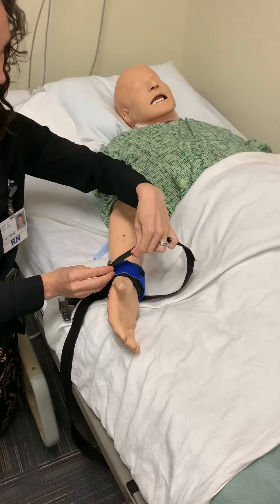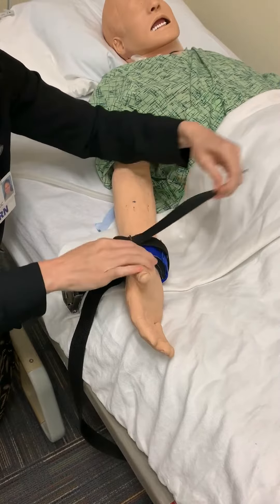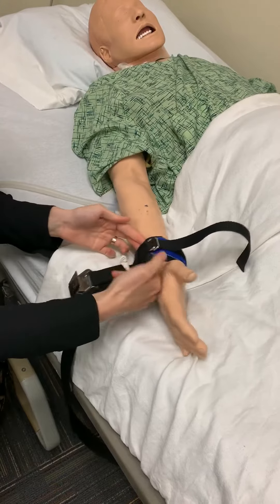It's like a belt — thread through two here, then back through one. Adjust it to fit your patient and check for fit. You want to be able to fit a couple of fingers in there.